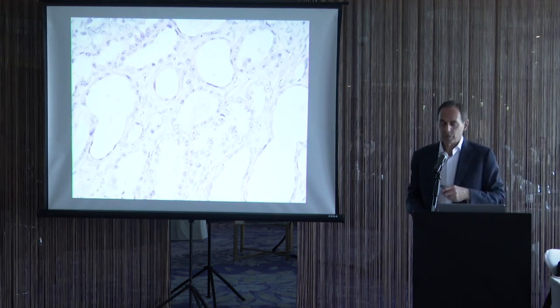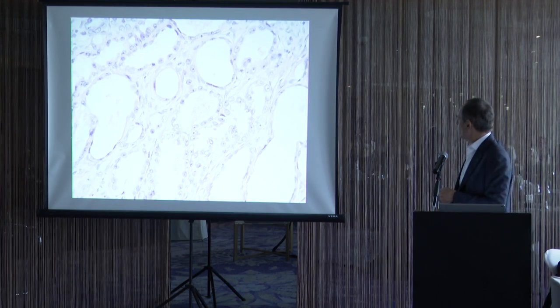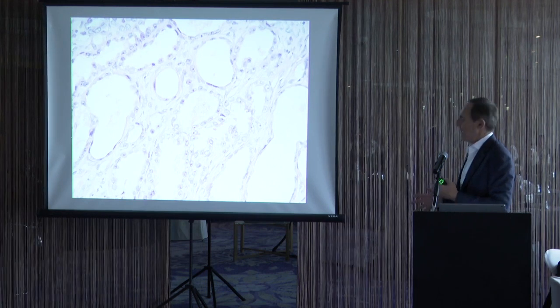Here's a case of atrophic prostate cancer with huge nucleoli, looking like a seminoma or melanoma type of nuclei. You don't see that in atrophy.